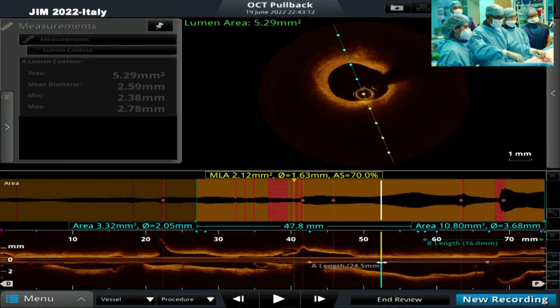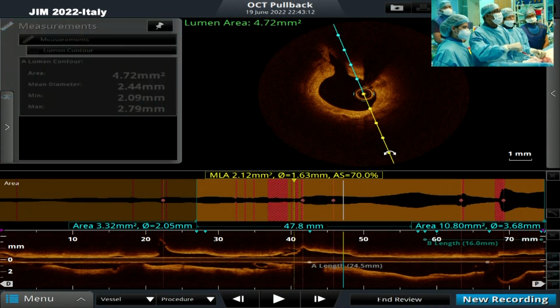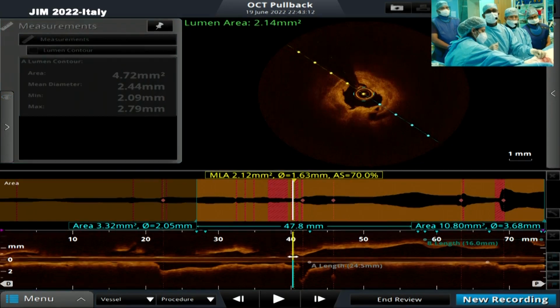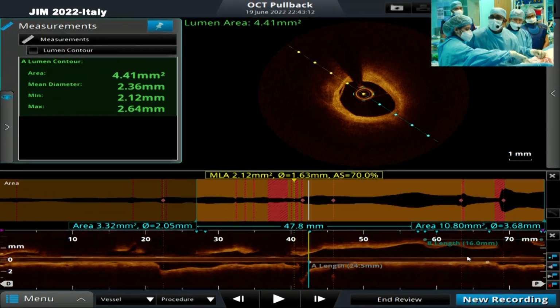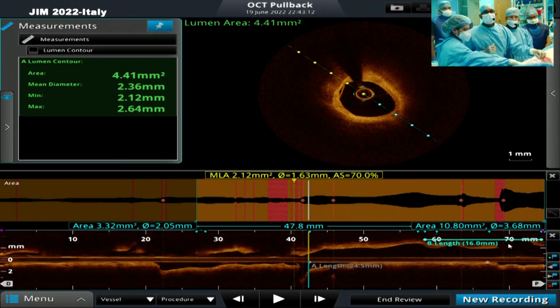And again, that's another good idea: precision PCI is not only precision in the quantity of the calcium and the lumens, but also precision in length. If we have this length, then we can calculate that perhaps a 38 or a 48 stent might do the job fine, in my point of view. Then we can see where you end up.